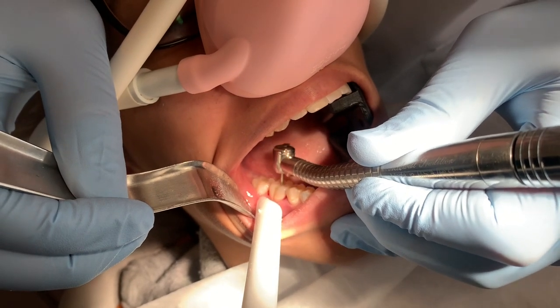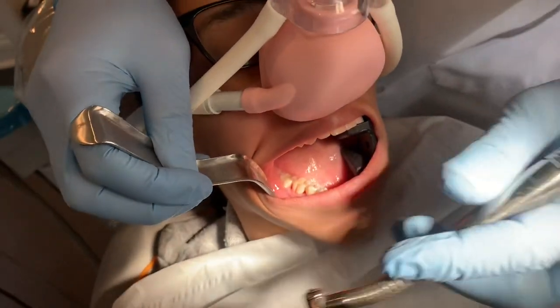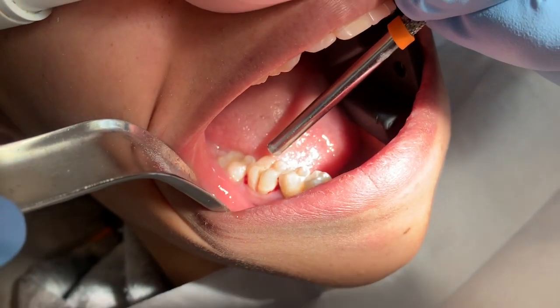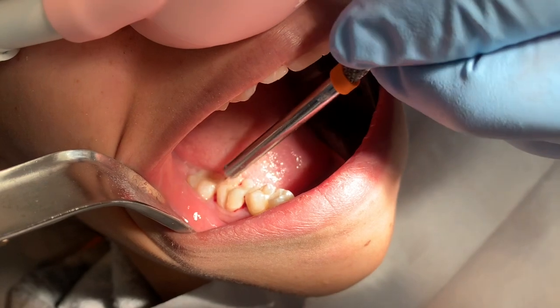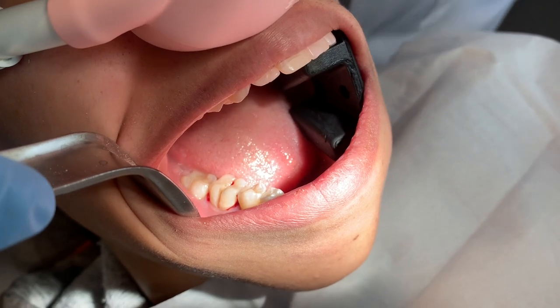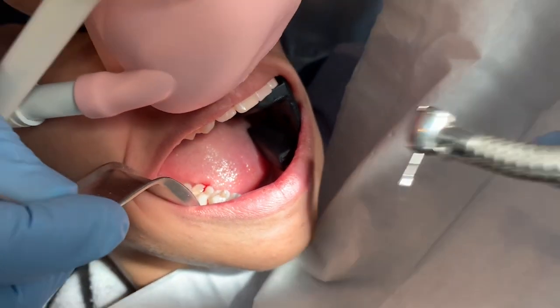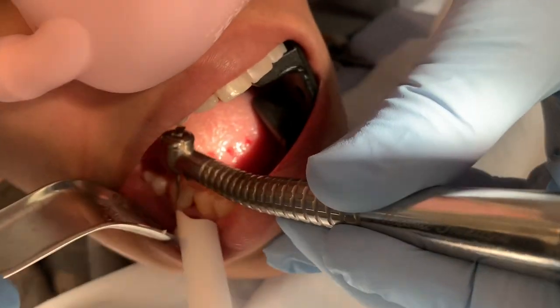It's really easy to tell if the tooth is alive at all anymore. Here, go ahead and take that away. If you look down in the tooth, I don't know if you guys can see this, but this tooth actually still does have some living tissue in there. That is a lot of blood for a tooth. It's only a few pinpricks worth, but this tooth has probably been hurting for a while. And these teeth will have three or four nerves in them. And the truth of the matter is, there's probably one or two that's dead and another one that's alive. It doesn't hurt, right? Mm-mm. Okay. Let's keep going here.